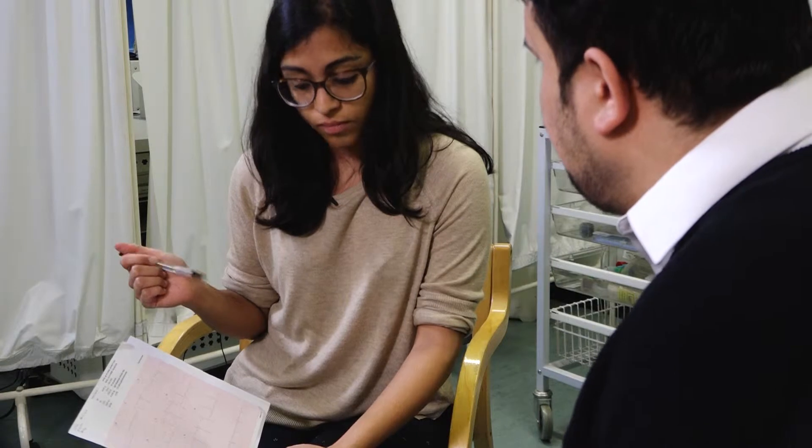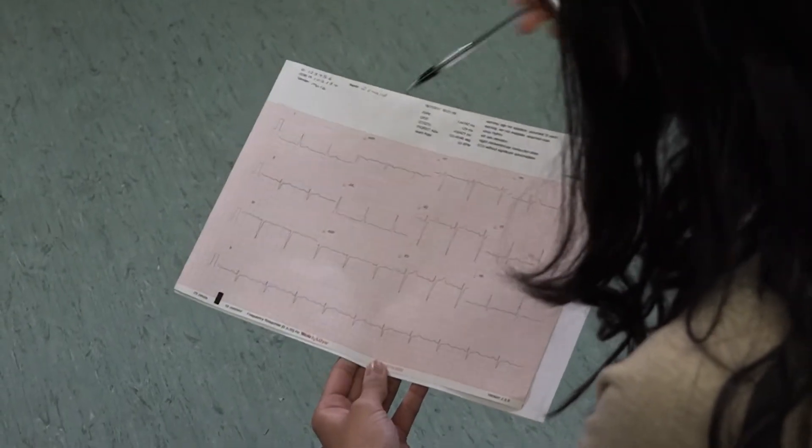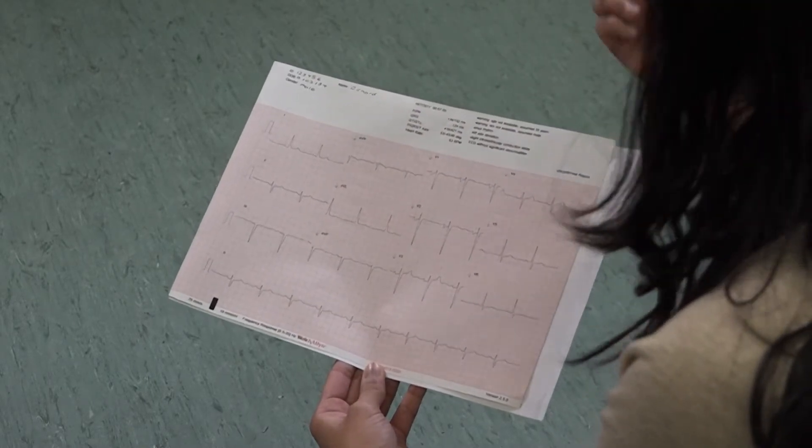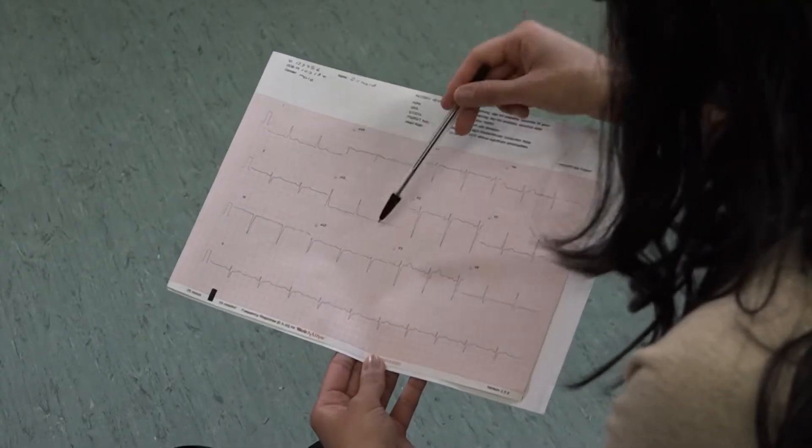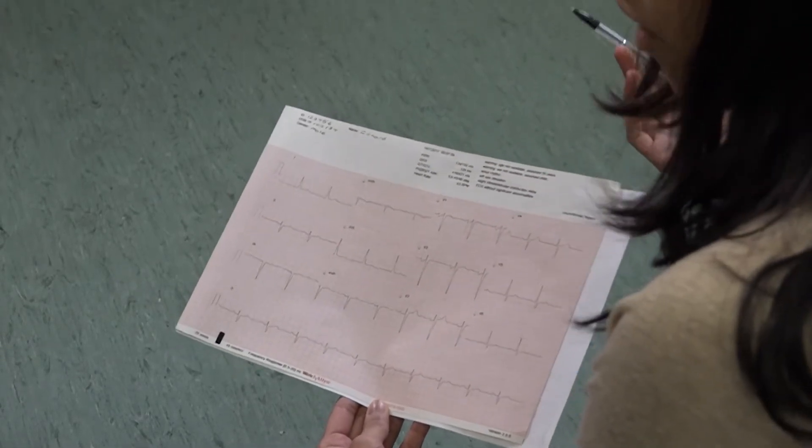And how do we determine the axis for the ECG? There are lots of different ways. One of the simplest ways is to look at two leads: leads one and leads AVF. A normal axis is when the QRS complexes in both leads one and AVF are both pointing upwards. That means they're positive QRS complexes.